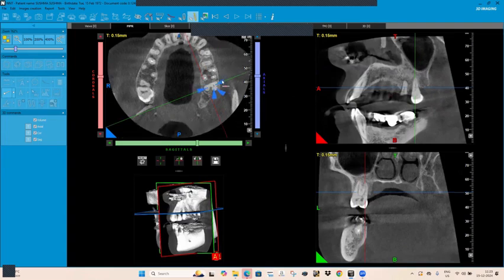So in this way, we locate the different canals through CBCT. In usual practice, we think that there are 3 canals in the molars, like mesiobuccal, distobuccal, and the palatal. Sometimes we get MB2 as well. But in this particular tooth, we get mesiobuccal, and in the distobuccal root we are getting 2 particular canals, DB1 and DB2. So in this way, this case came out to be something special. Any doubts on this one?